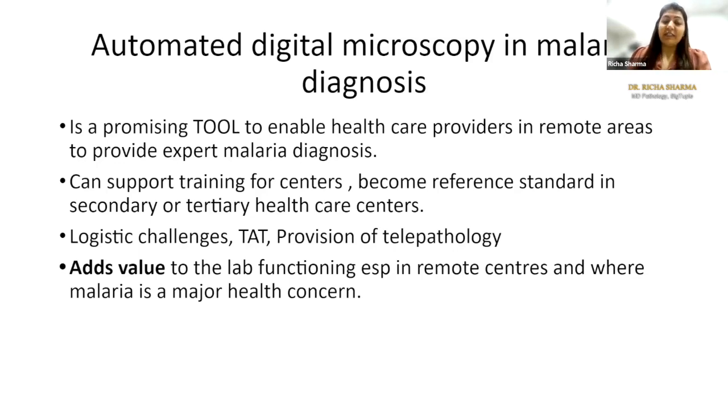I think I have established the use case. Yes, we should be doing that. So will it reduce the error? These are the only criteria we think of, and we think whether we need the automation or not for this particular use case. So we need an automation. It is also going to reduce the errors that happen in diagnosis.